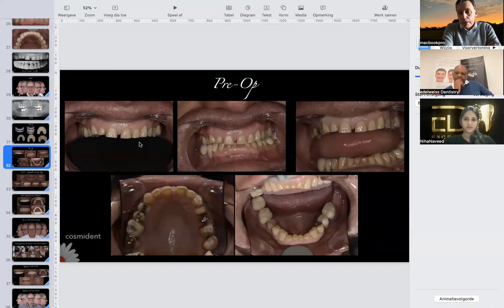And what happens is, at the moment you take out the splint, the patient asks you after 1 or 2 minutes already, doctor, can I get back my splint, because it's more comfortable if I wear it. Then you're sure that you have trained muscles and that you won't have TMJ problems afterwards. The problem I see in a lot of big cases like this is that a lot of doctors restore immediately with a definitive material like zirconium.